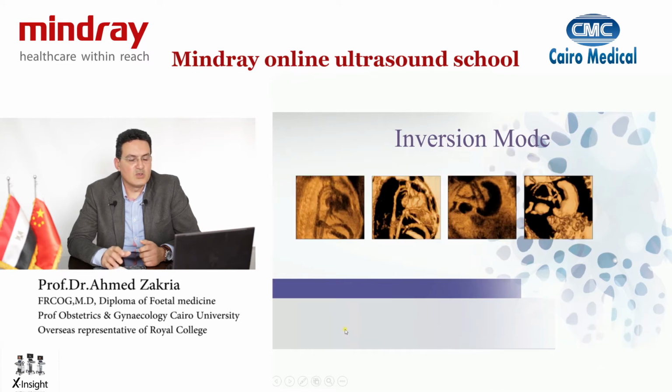And you can use this inversion mode in other examples. Instead of seeing the stomach as being black, you can see it as the echogenic structure, and you dampen all the other tissues around it. For instance, this is the stomach here, where you can see the double bubble sign and duodenal atresia, and you can see that's the stomach, that's the dilated pylorus, and that's where the obstruction is.